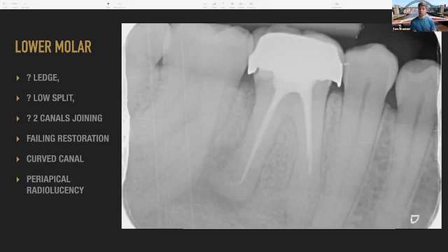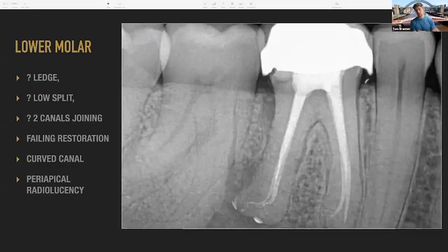Our referring dentist will replace the crown quite soon after, with that caveat that actually with the microscope I can still check and make sure that I'm happy there's no root fractures or cracks running through the tooth as well. Because if you make a reasonable access through the crown, you can still check those to a degree. Not quite as well, I would say, as taking the crown off completely. And this one was a bit of a brute of a tooth.